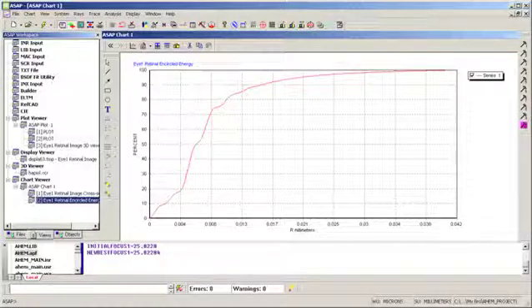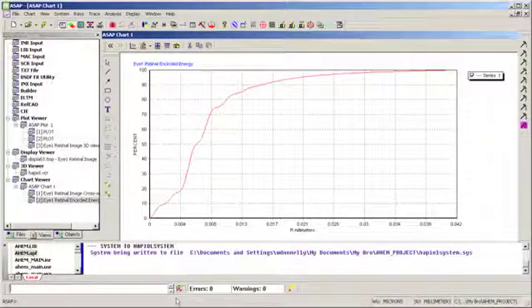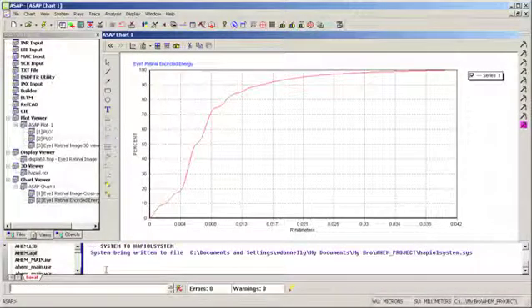So in order to do the lit appearance model, I need to take another step with AHEM. I need to export the geometry as a system. So I do that with a SYSTEM TO command, and then the name of the file that I want. And now I'm exporting all this geometry and all the media and all the settings so I can process this externally. So I've done that.